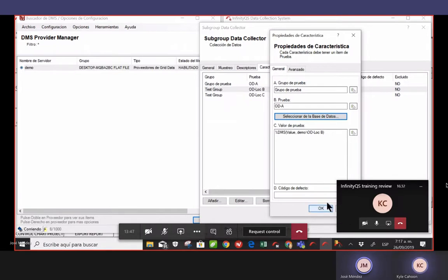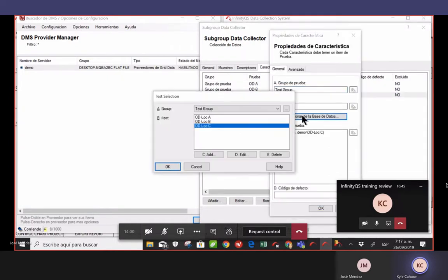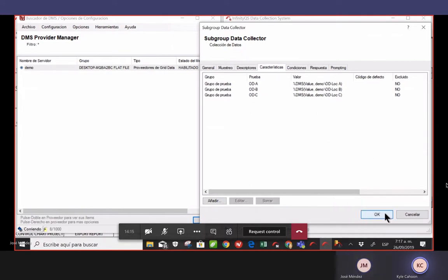Nope, just make sure you choose OD location B. Thank you. Okay. Very good.